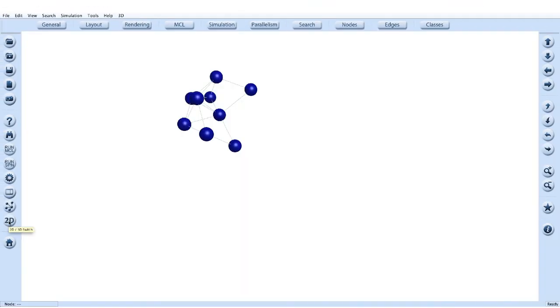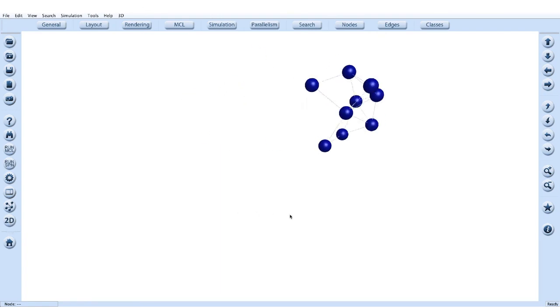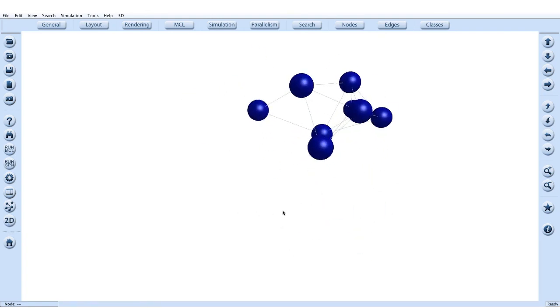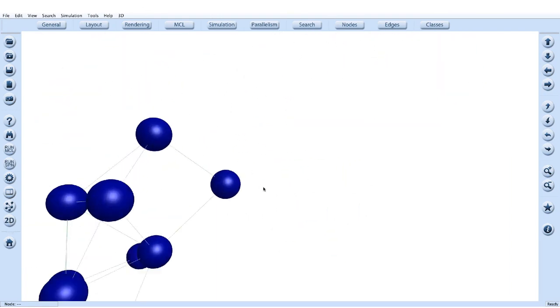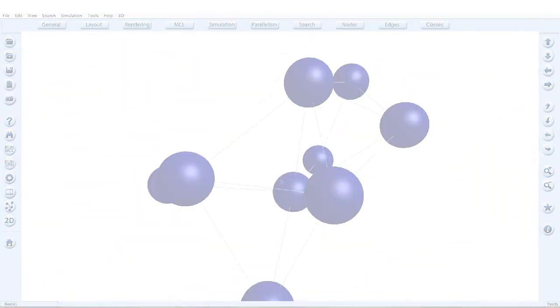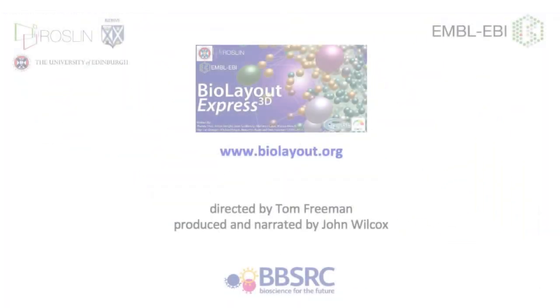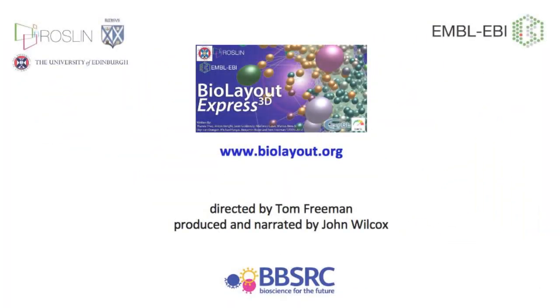So let's return this graph back to the 3D view, and that's all for this training video on graph navigation in 2D and 3D with BioLayout Express 3D.